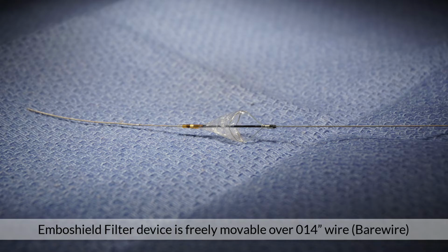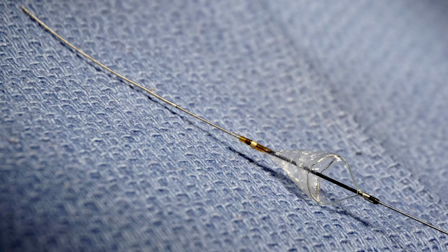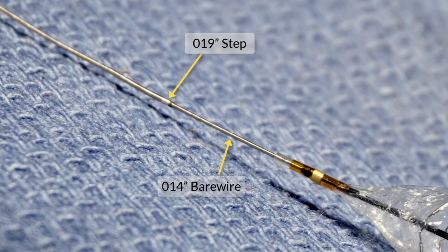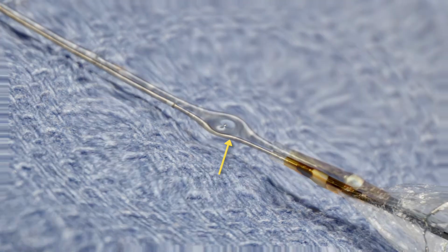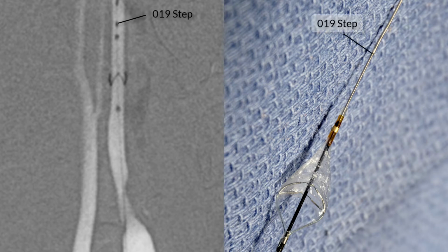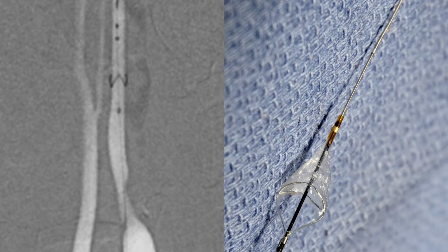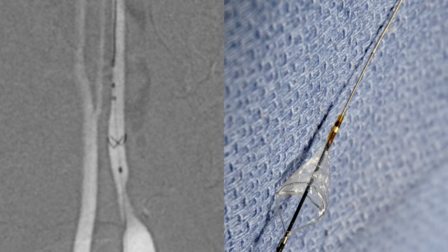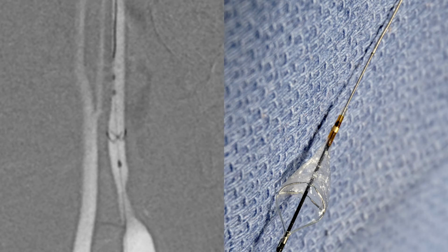It is freely movable on this wire, and because of this there is a risk of intracranial dislodgement of this filter device. To avoid any intracranial migration of the Emboshield filter device, there is a focal step designed on the bare wire distal to the filter. This focal step is 0.019 and will act as a distal limit of the filter device. So when this distal 0.019 step at the bare wire is in contact with the distal marker of the filter device, it might drag the filter proximally if the bare wire is pulled by mistake during the exchange maneuver. And this is exactly what had happened in this case.